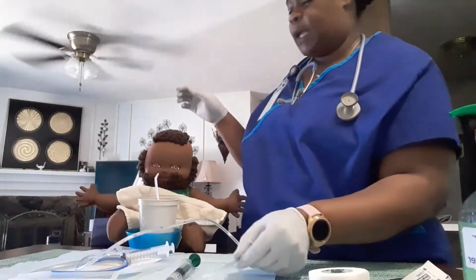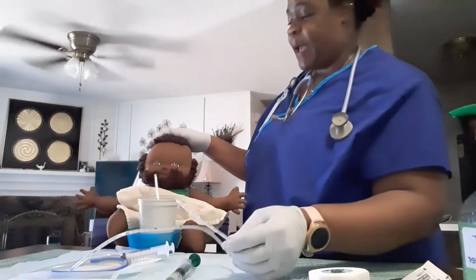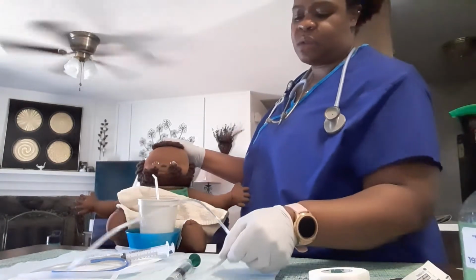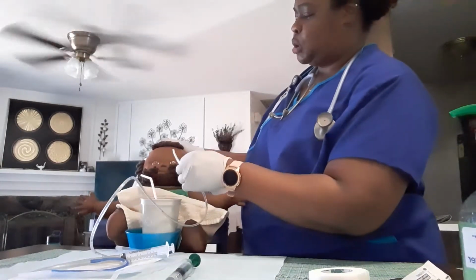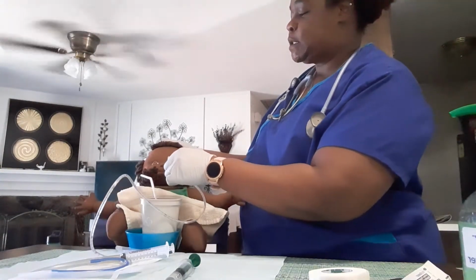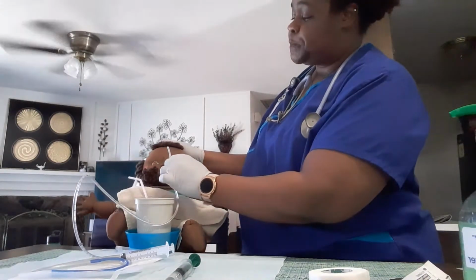So I'm going to lubricate. My patient's in high Fowler's. I'm going to have them hold their head back as far as it'll go. And I'm going to lubricate the first 4 inches. I'm going to take the lubricated end and insert going back towards the sinuses.